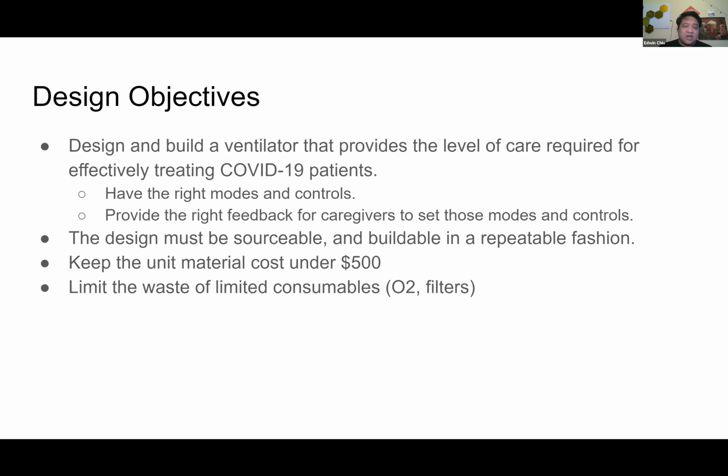The other objective is that the design has to be sourceable and buildable in a repeatable fashion. We're also trying to keep the unit material cost under $500, or some number around there. The idea is to make something more buildable and more affordable for the countries we're trying to serve. Finally, another design objective is to limit the waste of consumables, which are limited supply items, such as HEPA filters and the hospital's O2 supply.